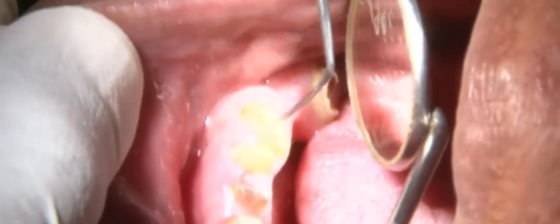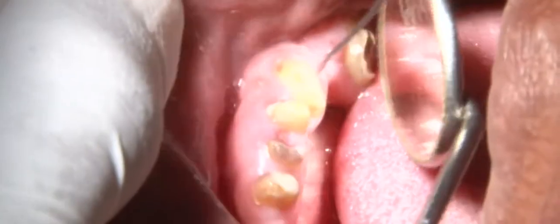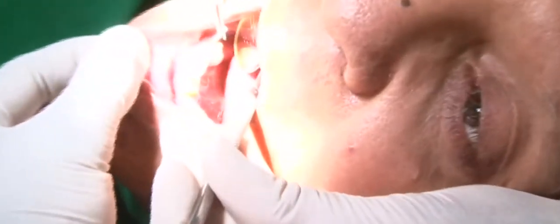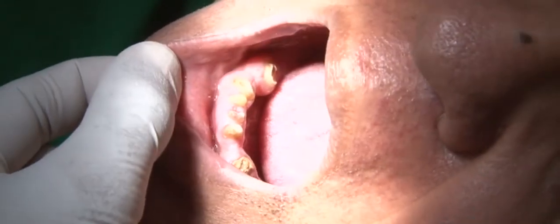Once this is done, we will check the canal space again for any remaining gutta percha. After thorough debridement and cleaning, we will try the post in the canal space for a snug fit. As you can see, the post fits adequately in the canal well. If required, one may take appropriate radiographs at every procedure.